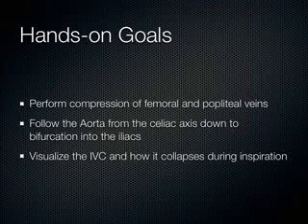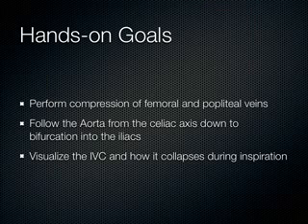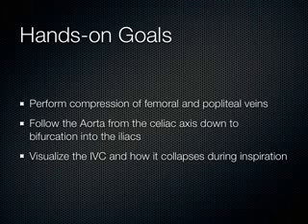Okay. So today, with the hands-on session, we're going to do compression of the femoral vein and the popliteal vein. Okay? You'll see how fast this goes today. It's going to be a pretty quick scanning session, I think, because you're just compressing the fem area, then you go down to the pop, and then you're going to follow the aorta down until it bifurcates. And then I want you to look at the IVC and how it collapses during inspiration.